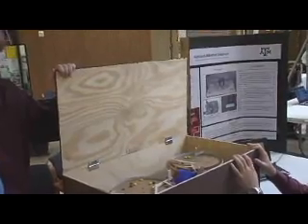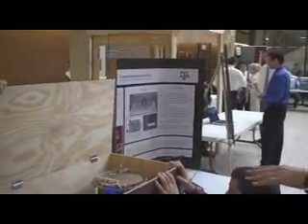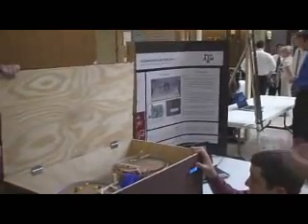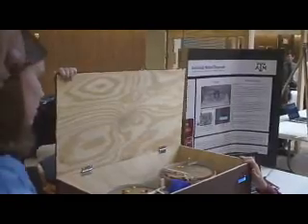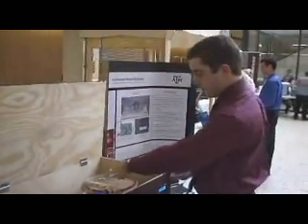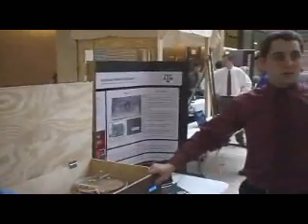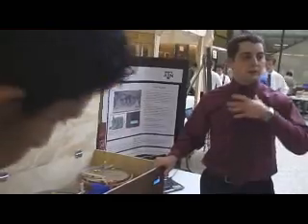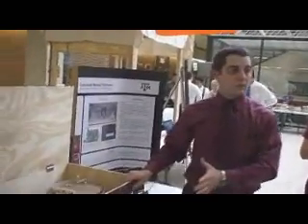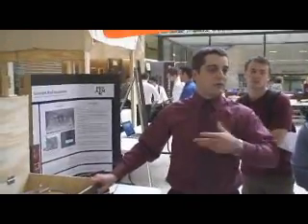I'm just curious. It seems like it works relatively okay for one time. What happens the second time, third time? Right now, I have it set for 12:45 and 1 o'clock. So I'm just going to make it go to 12:44. When it hits the minute mark, it'll activate. It would still be 7.5 minutes before. We can change the actual clock, so we can just skip those minutes.